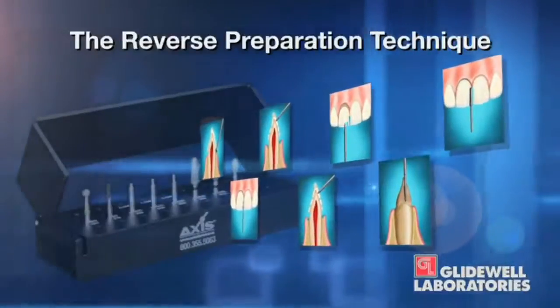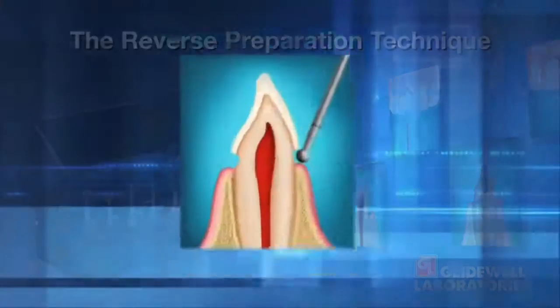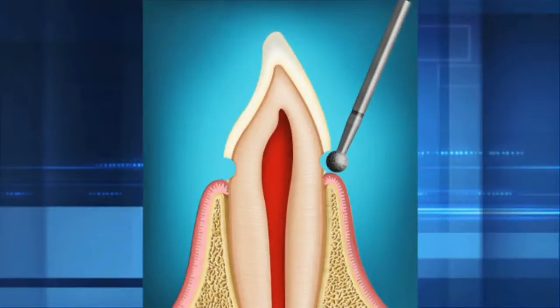It's called the reverse preparation technique because, unlike in dental school where we were taught to prepare the rest of the tooth first and the gingival margin last, this starts off by prepping the gingival margin first. That makes it much easier to get a nice, uniform, clean margin — which is critical because it assures that your laboratory can give you a restoration that fits very well at the margin. By prepping the gingival margin while the rest of the tooth's hard structures are still intact, it's much more predictable. From the very first time I tried this technique, I saw it was something special — I didn't wake up with a better set of hands; I woke up with a better technique.